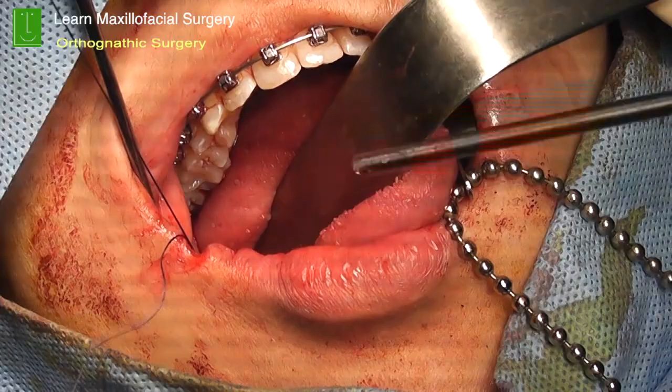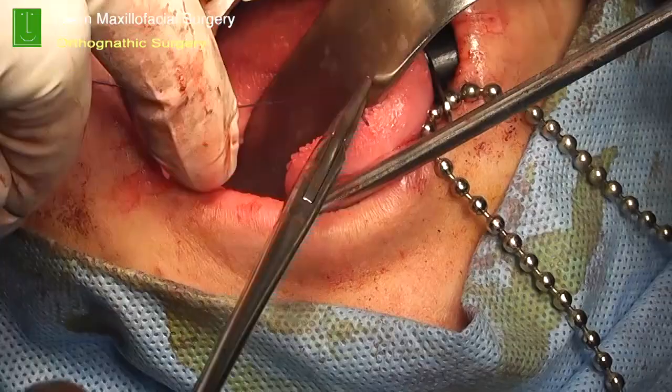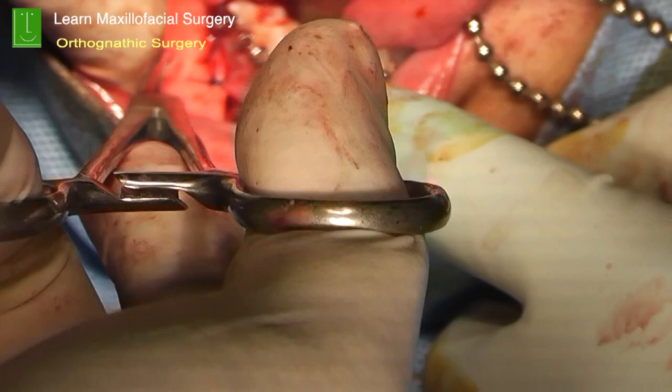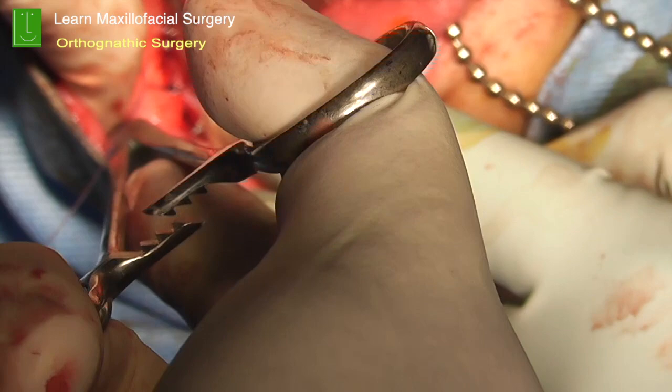I also like to use a small drain so that any blood which accumulates in the pterygomandibular space can be easily sucked out. You can put it either into a suction apparatus, like a mini suck kind of thing, or you can just simply use a small catheter. A number 8 or 10 catheter can be placed in the buccal vestibule so that it just allows any hematoma which is collected over there to ooze out.